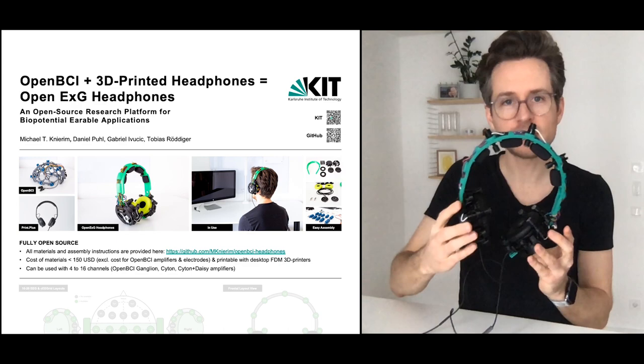Hi everyone, this is Michael, excited to talk about our latest research. These are 3D printed biosensing headphones.